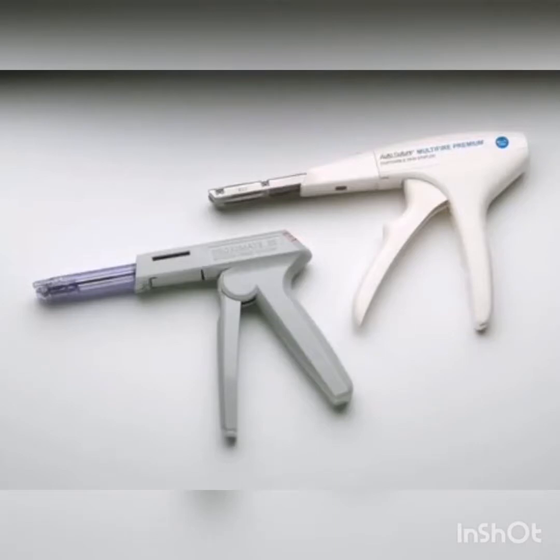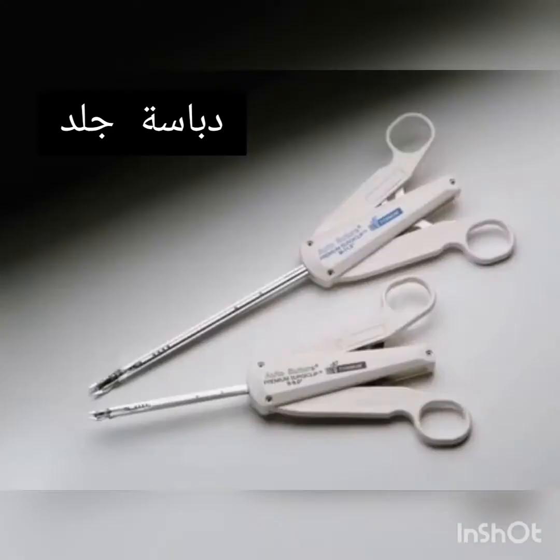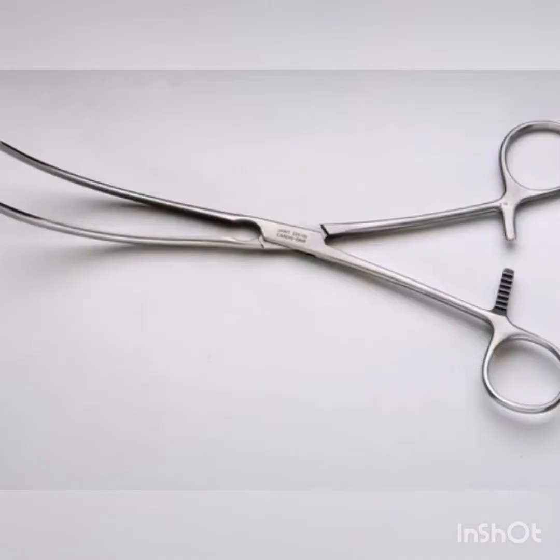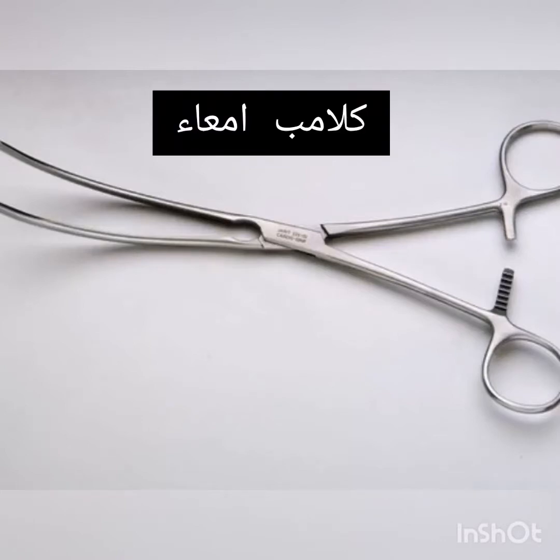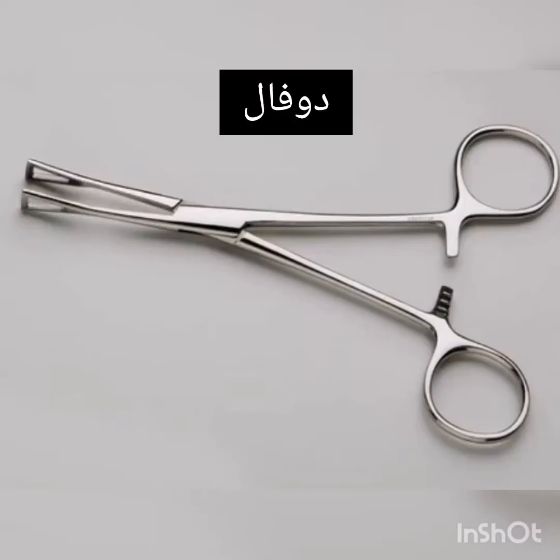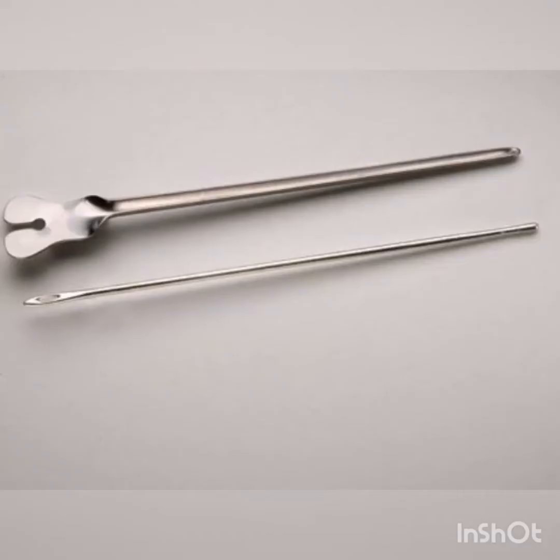Skin Stapler. Surgiclip. Carter-Glassman Intestinal Clamp. Doyen Intestinal Clamp. Pennington Forceps. Probe and Groove Director.